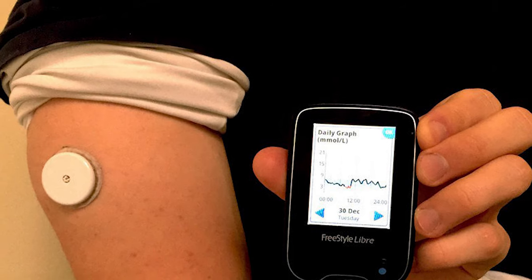Freestyle Libre is not super expensive compared to the Dexcom — it's really not that expensive, so if you wanted to purchase it out of pocket you can do that. But the better option is you can try it for free, because not everybody is going to like the Freestyle Libre for a few reasons I'll explain in a minute.